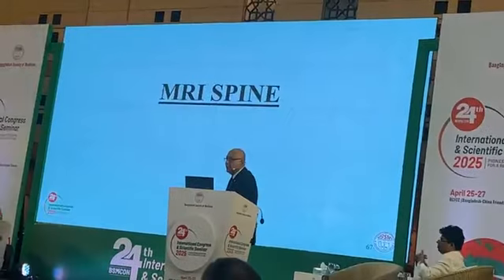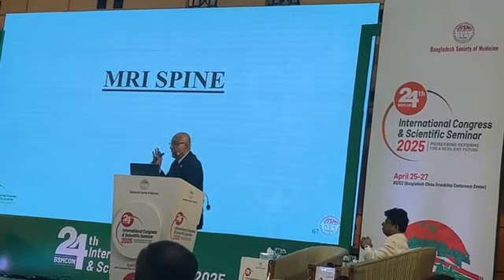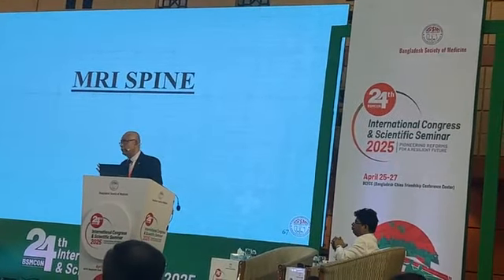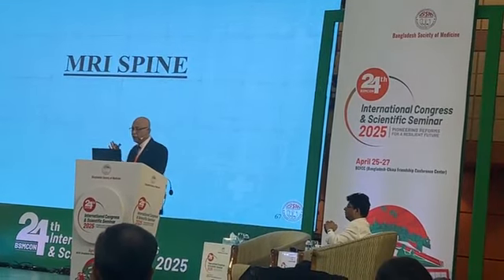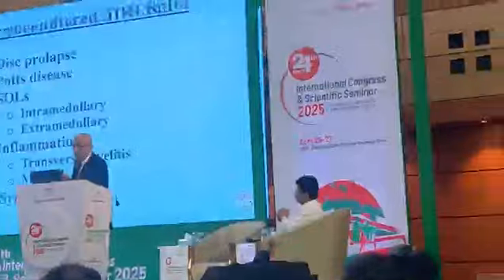So this is MRI spine, my last topic today. For spine imaging, neuroimaging, MRI is the choice. We cannot do a CT scan in the spine, we cannot see anything. So MRI is the investigation of choice in spine lesions.